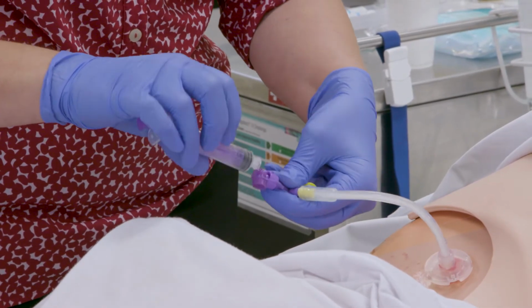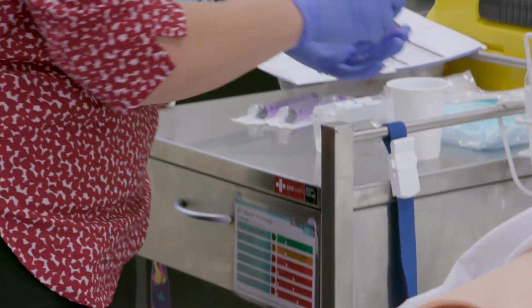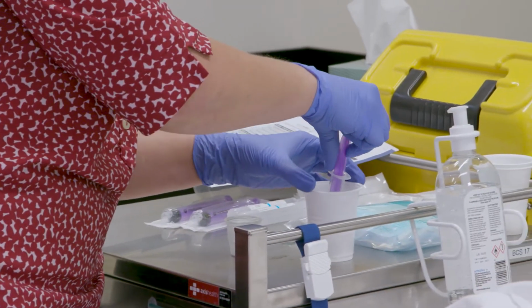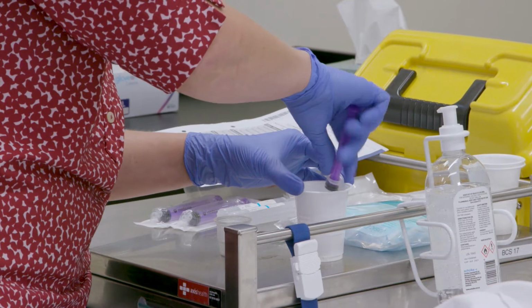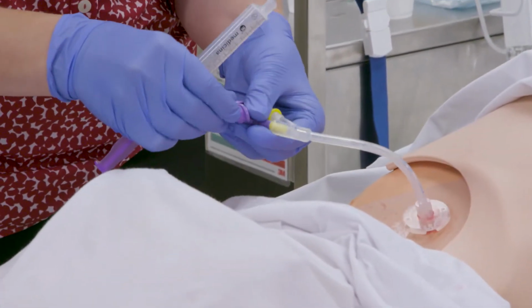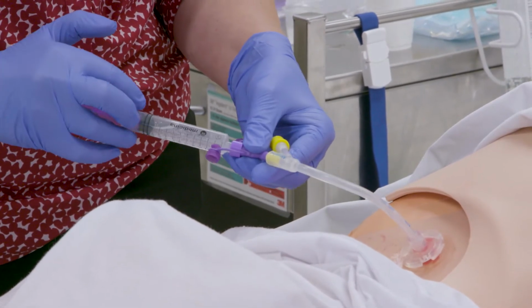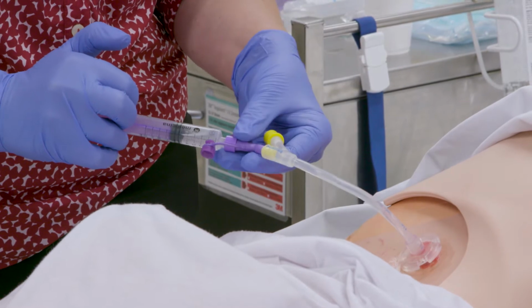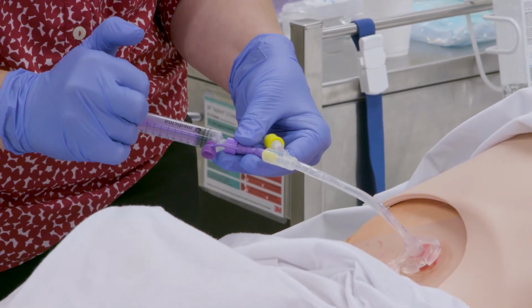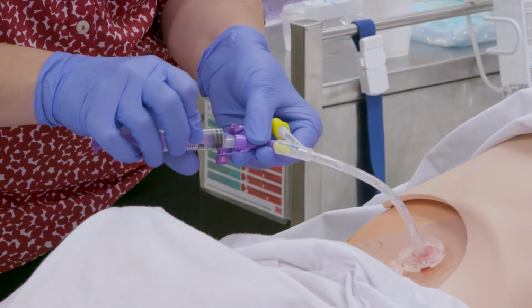Okay, it's important upon administration of the medication to flush that tube, and we want to flush it with a good 20 mils of water. Okay, flushing of the tube. If we were to leave any medication within the tube, that runs a risk that it will block, and we don't want that to happen.